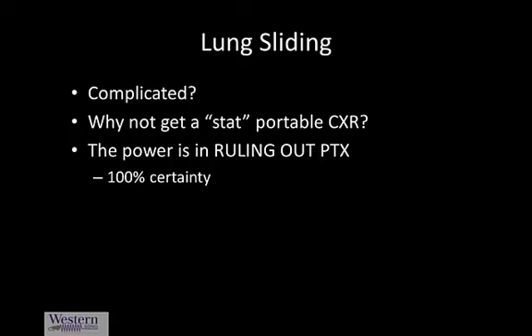Empiric needle decompression really is ineffective, we know from cadaveric studies in a lot of people, and certainly not a desirable thing to have to do empirically if you have a tool that can very quickly tell you whether or not a pneumo is present or absent. So the ability to rule it out is the power of this technique.